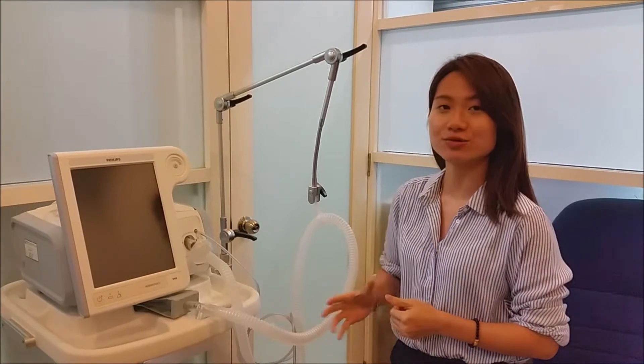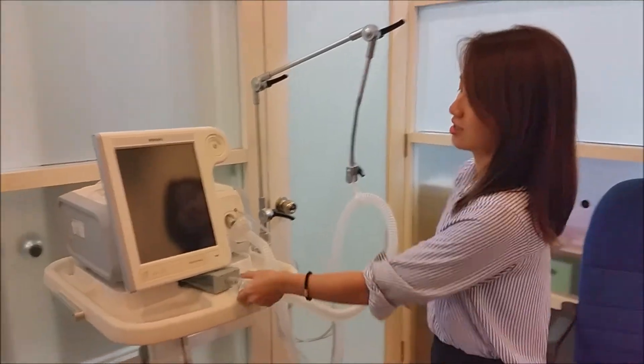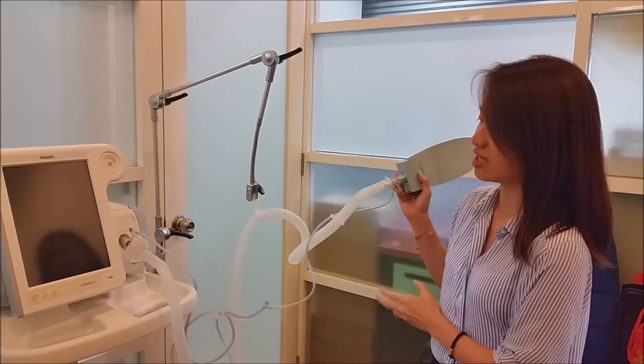Hi everyone! This is the Philips Respironics V60 Standalone NIV machine. I'm just going to show you the circuit setup first. This is a single limb circuit, which is an open circuit.